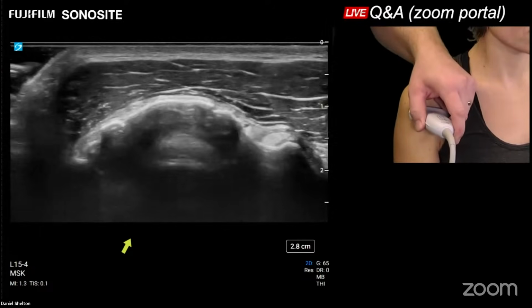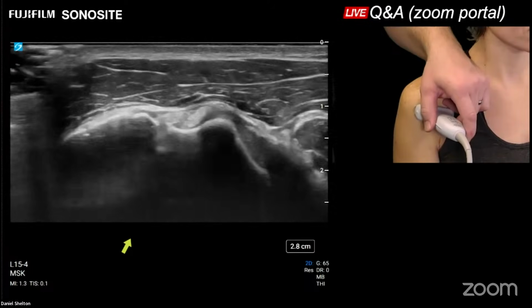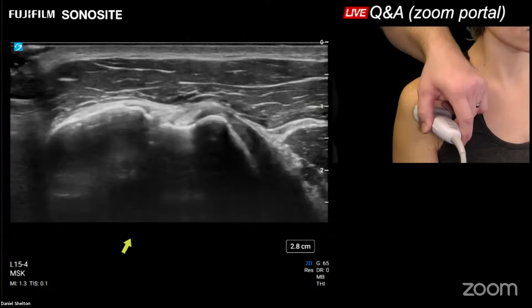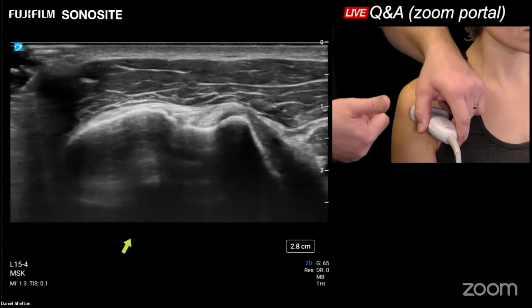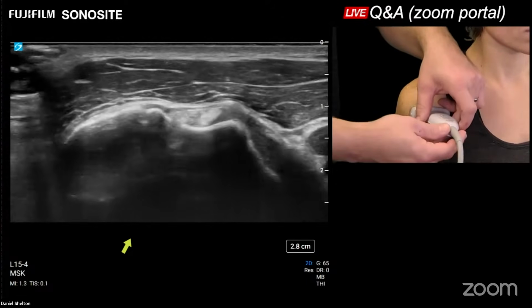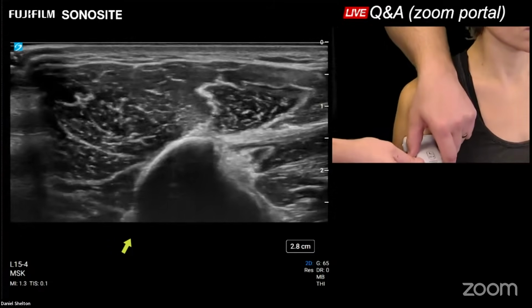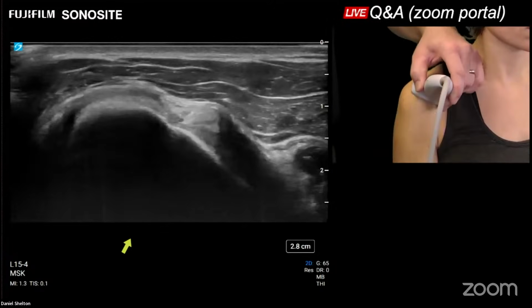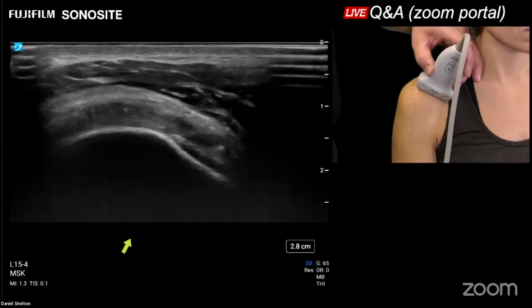Remember, we had our palm up in the lap, and we take a look at that biceps tendon and its groove. We've got lateral side, screen left, kind of like you're looking at an MRI. So we're looking at a right shoulder, and I've got the orientation marker facing lateral. So that's a short axis biceps we have on the screen. You take that on down to the pectoralis. If you haven't found any pathology, come back on up into the inner part of the groove. Keep following that short all the way into the rotator cuff interval.